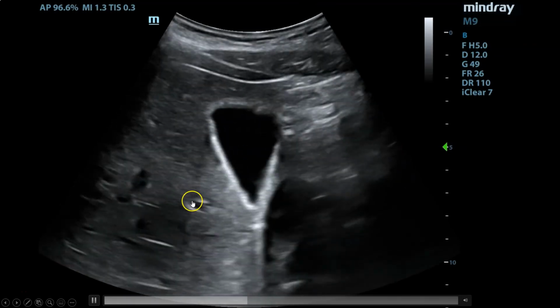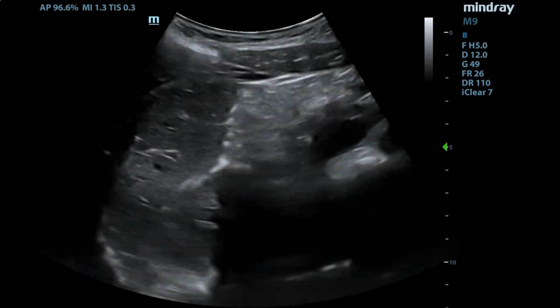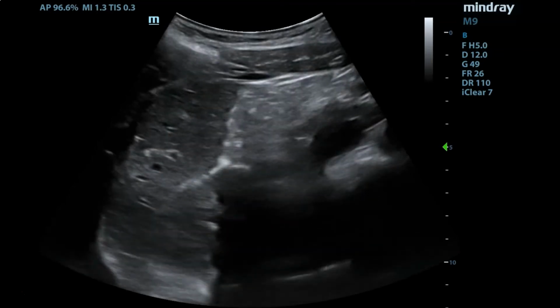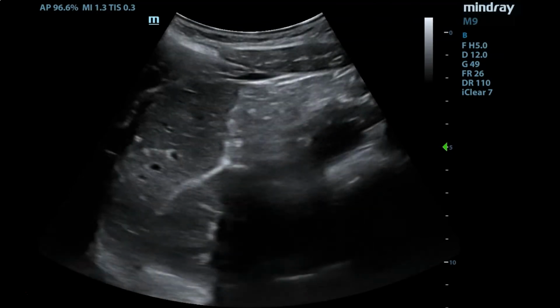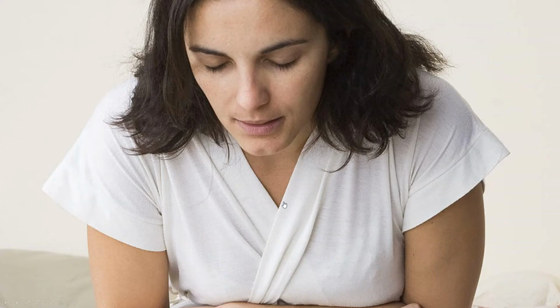And the goal is to sweep through from beginning to end. And as a reminder, sweeping is when we'll sort of have the probe flat, and then you'll change the way the probe is oriented without actually moving the probe towards either curved end. You're just sort of tilting the probe away and towards you. Again, this will be easier when shown hands-on.